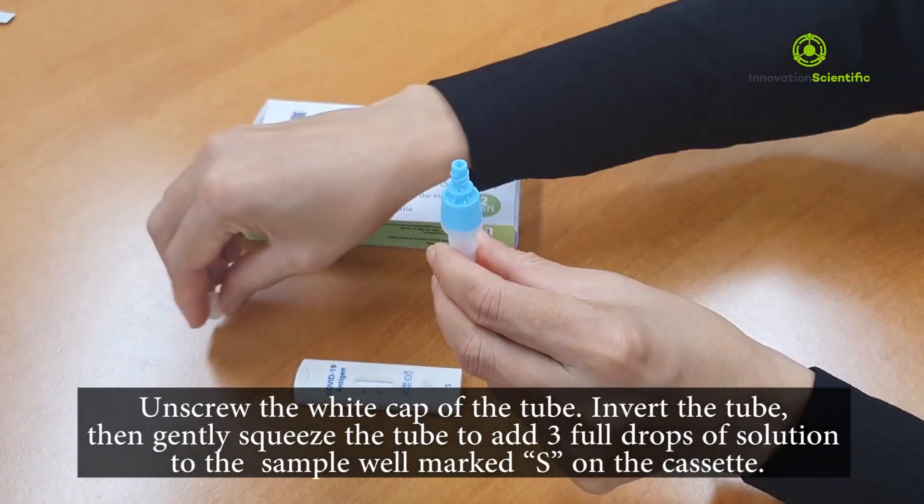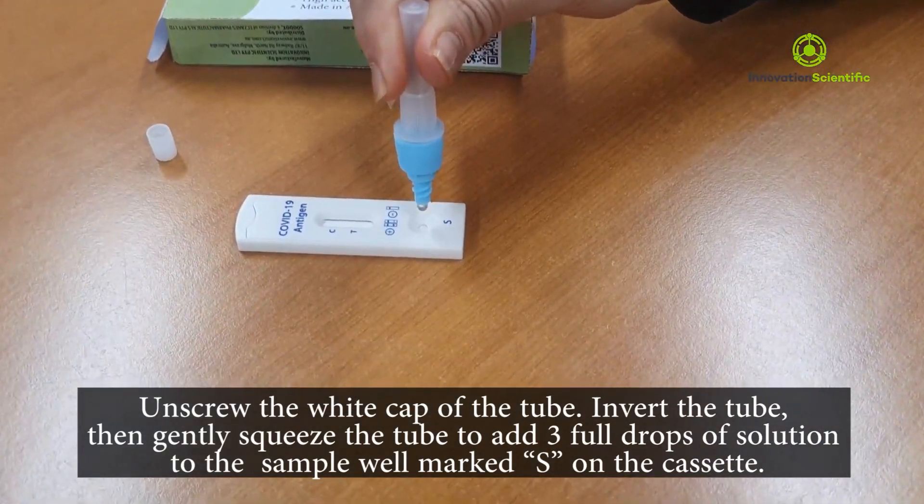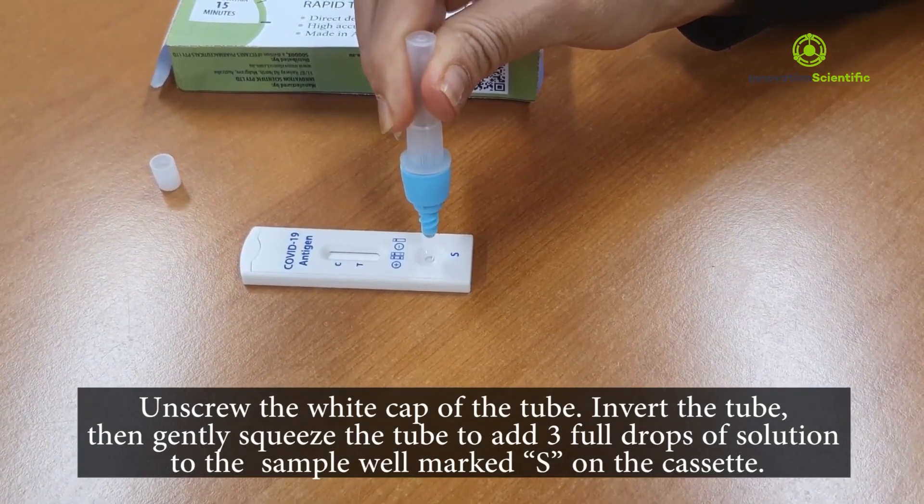Unscrew the white cap of the tube. Invert the tube and then gently squeeze the tube to add three full drops of the solution to the sample well marked S on the cassette.